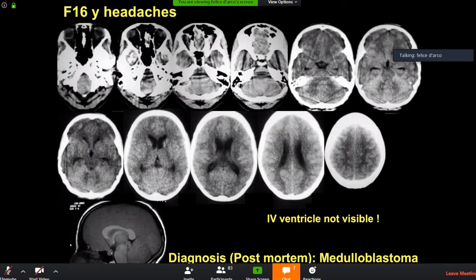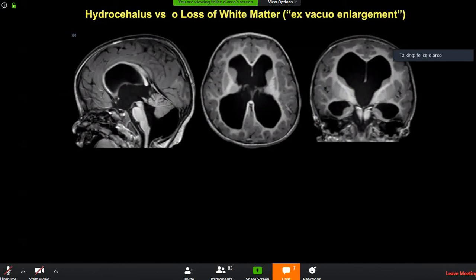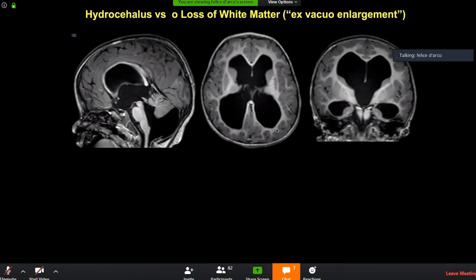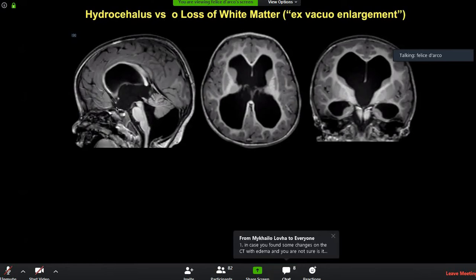Now to show the difference between true hydrocephalus and ex-vacuo enlargement: look at this child born with enlargement of the fourth ventricle — a posterior fossa cystic malformation called Blake's pouch cyst. The ventricles are dilated and there is loss of white matter, so there is an ex-vacuo component. But most importantly, the third ventricle is displaced inferiorly and anteriorly.